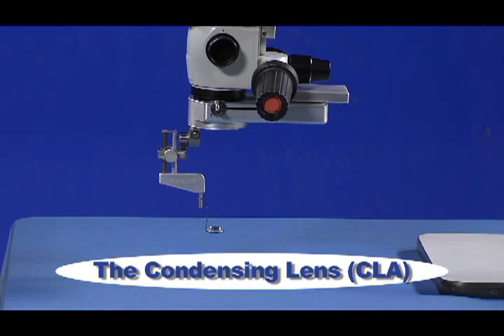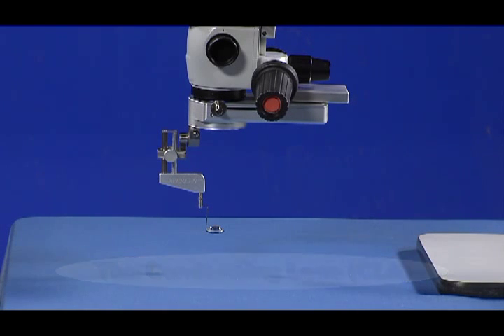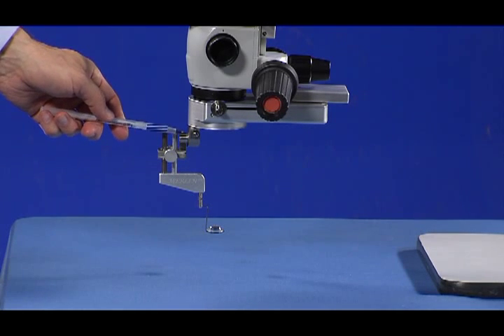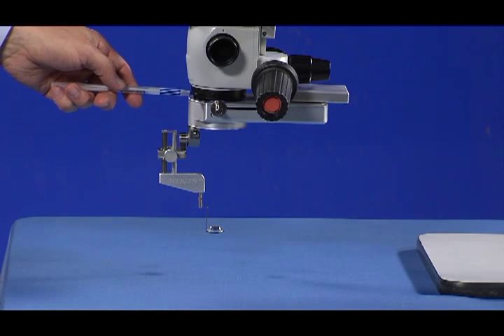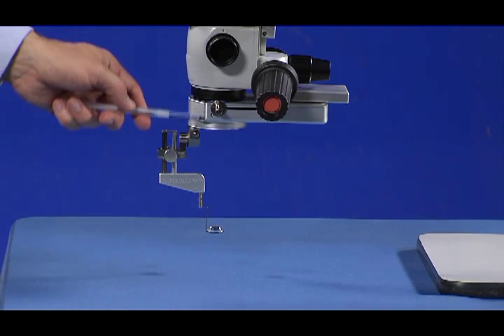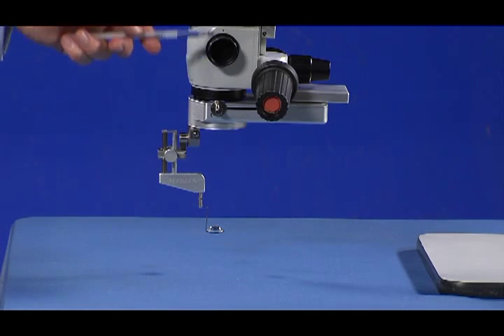Now let's look at each of these components in more detail. The CLA has two main functions. First, to provide the anchor point for suspending the LPU and surgical lens below the objective lens. And second, to properly align the system to the microscope's optical path.